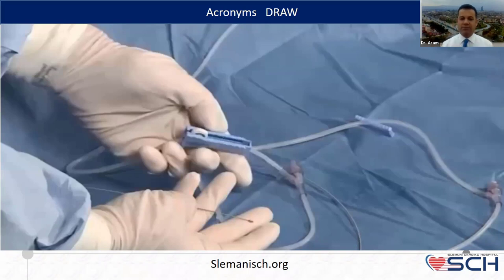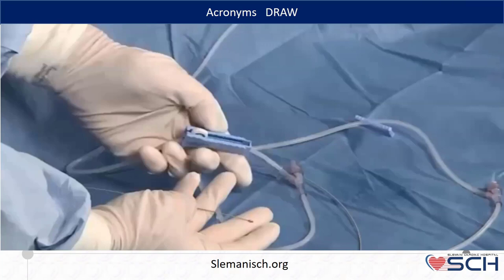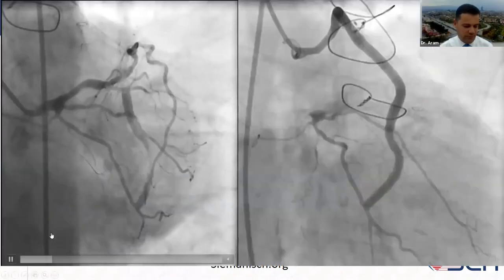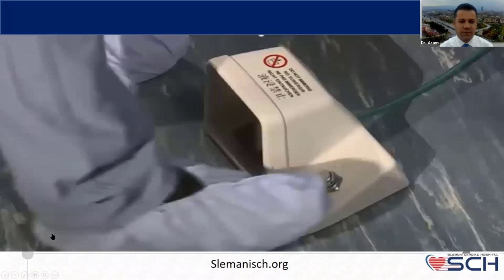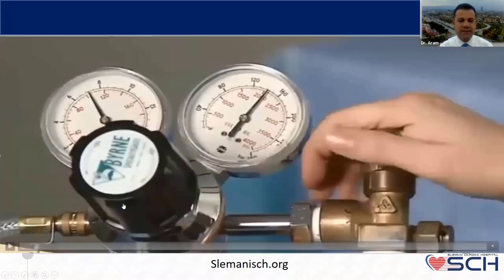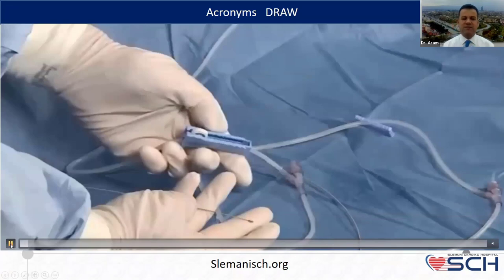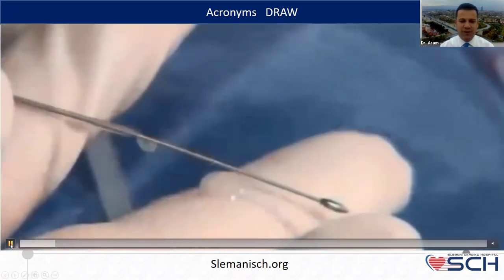Never forget, anybody working on the rotablator should keep in mind the mnemonic DRAW. DRAW is the acronym for three or four things. The first one is D, for drip. So look to the drip.